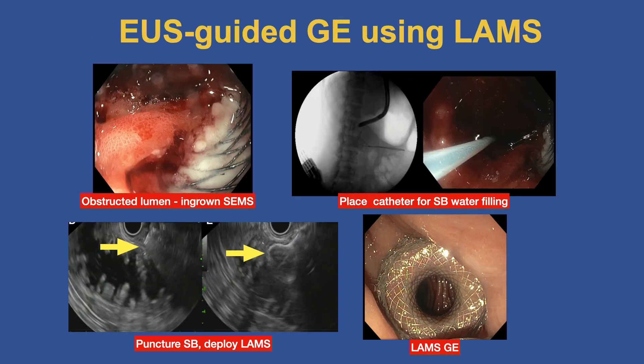Using the LAMS: here is a patient with an ingrown SEMS, completely blocked — couldn't eat, nausea, vomiting, just miserable. We place our catheter for filling of the small bowel because we need to see it well; the water makes things black so we can see everything clearly. Then we puncture the small bowel with our hot delivery system — which I also developed — allowing a one-step entry into the small bowel with immediate deployment of the LAMS. Then we deploy the LAMS, and here you can see the gastroenterostomy.